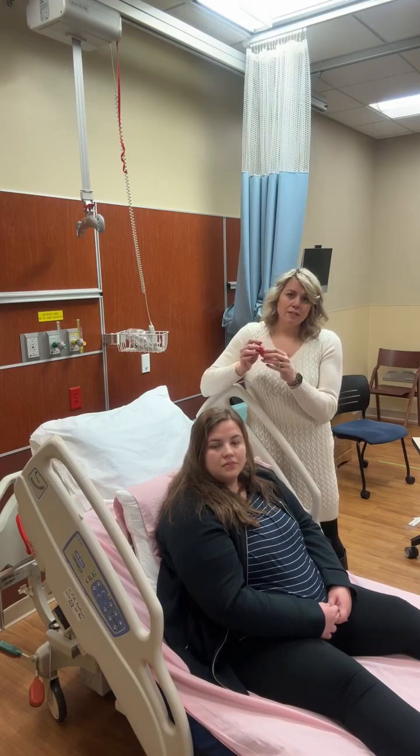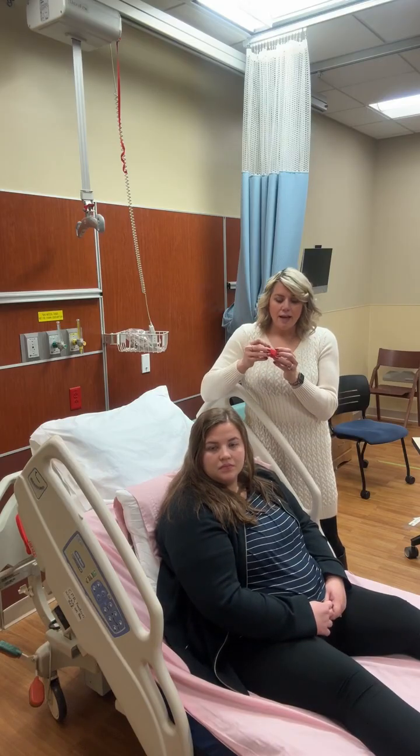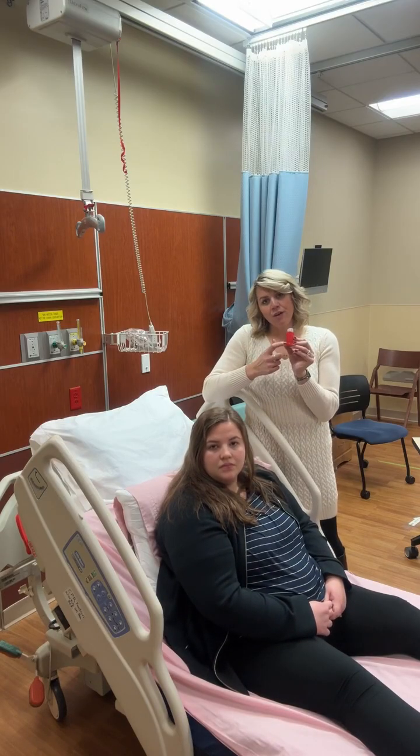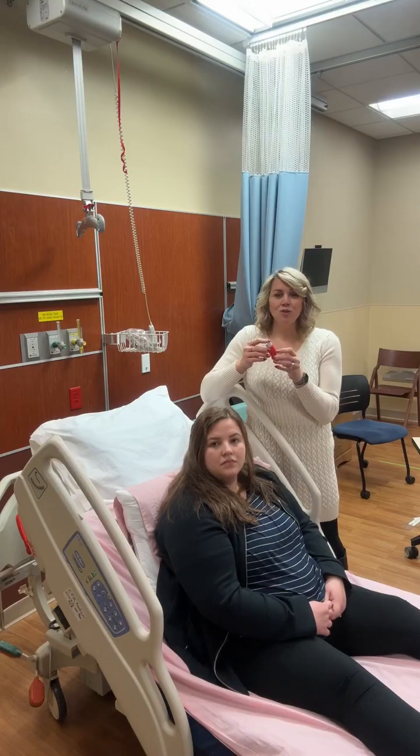Also, extreme heat is not good for it either. So keep it in a room temperature room. And make sure you're watching your counters so that you know how much is in here, so that you aren't going to get it when it's empty. It's not going to do you any good if there is no medication inside of it.